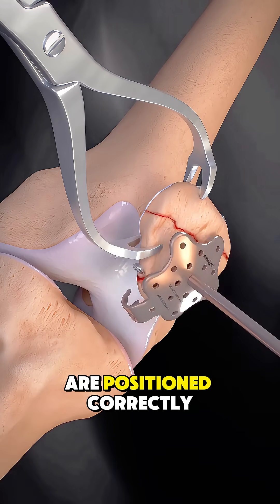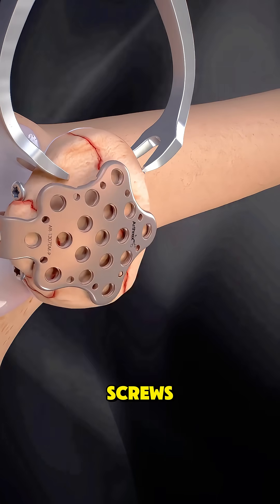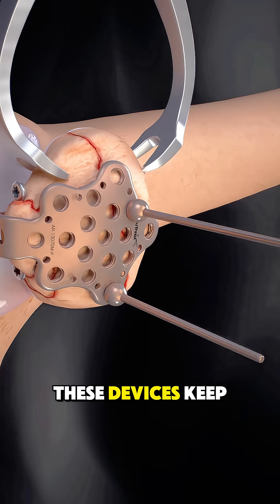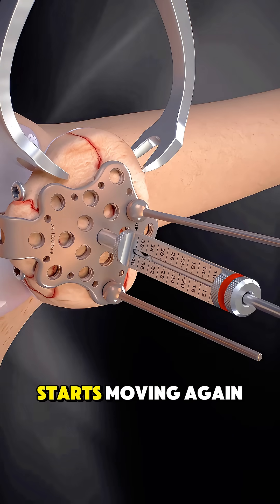Once the fragments are positioned correctly, the surgeon uses medical hardware, like screws, pins, or a special tension band, to hold everything together securely. These devices keep the bone stable so it can heal properly as the patient starts moving again.